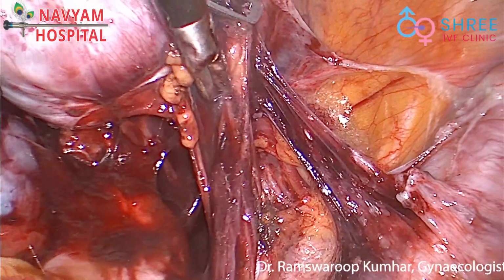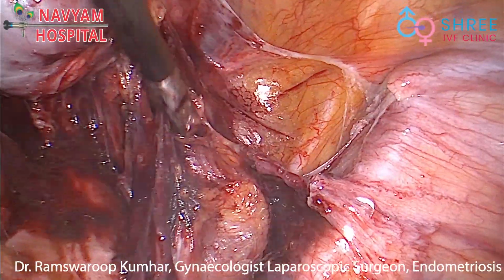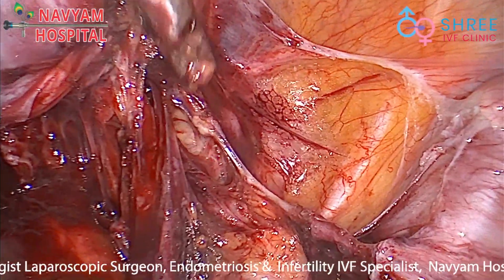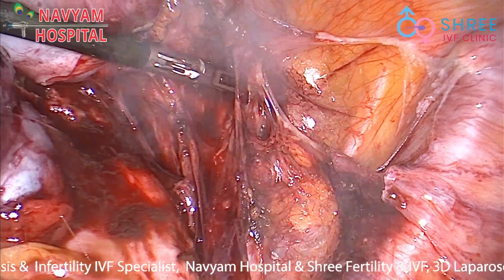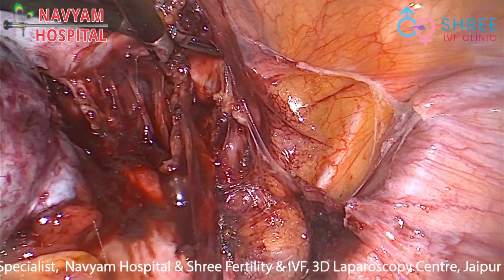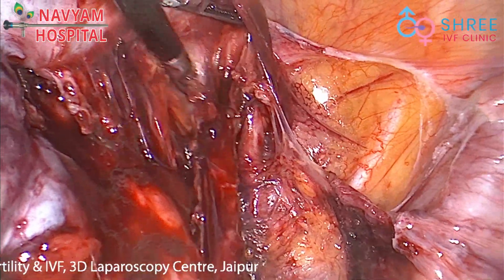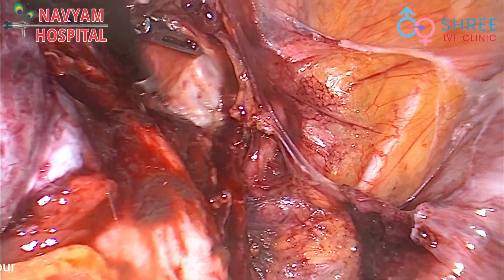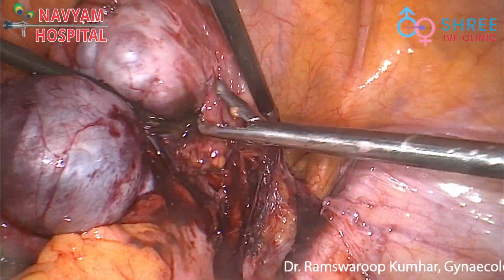The right ureter was densely adherent to this right tubo-ovarian mass, so proper gentle dissection was carried out in the form of sharp as well as blunt dissection. Here the mass helped us in the dissection, so we did not puncture it, and it remains intact.